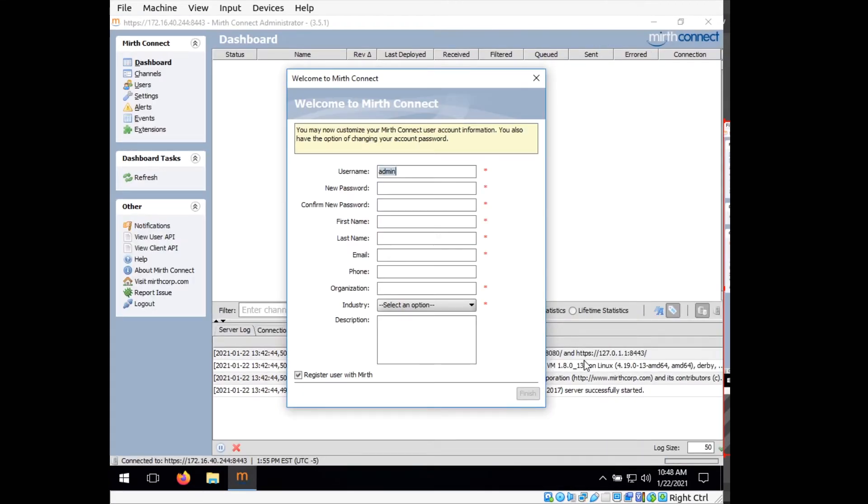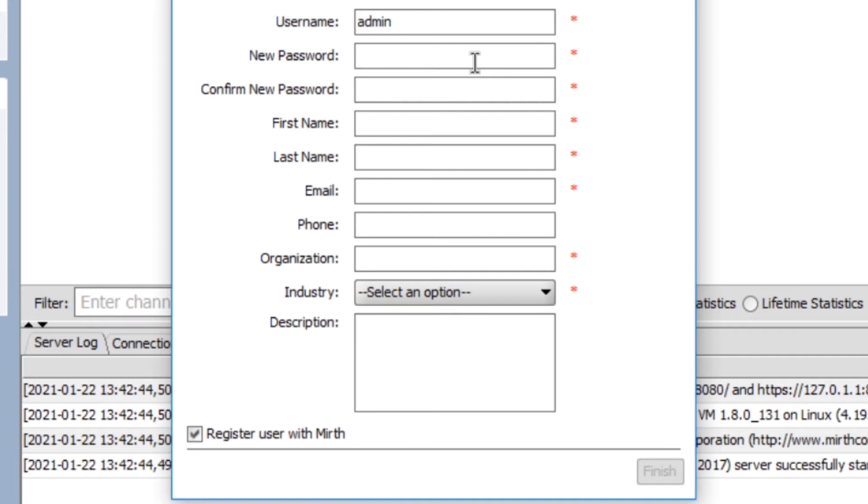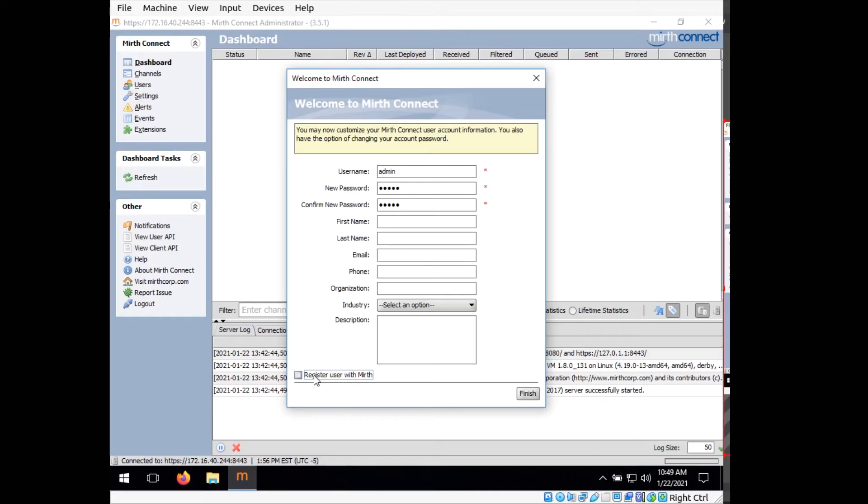Okay, so now you have this window that comes up and you'll have this first startup window. This lets you change the password for the admin account, which is a good idea if you are planning to put this into production at some point. But because this is just an example, I'm just going to leave the password as admin. So the username will be admin and the password will be admin. I'm going to deselect register with Mirth and select finish.